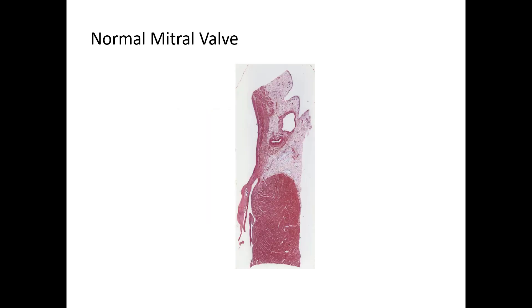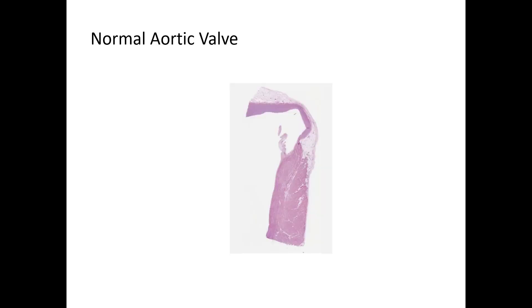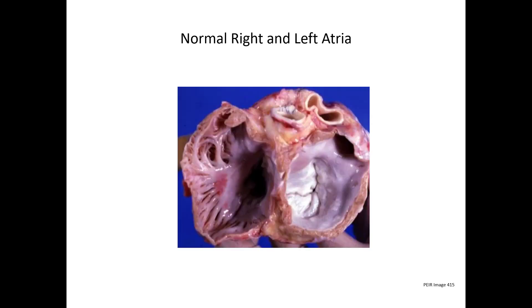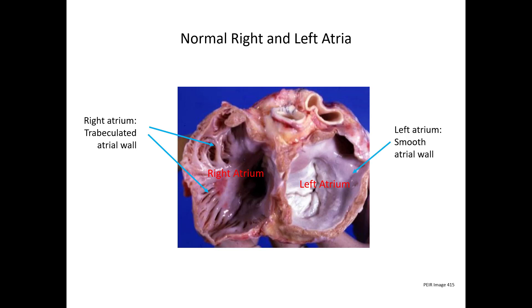Let's go on to our summary. The first slide was a normal mitral valve — you can stop the video and name all the structures to test yourself. The next slide was a normal aortic valve, and again you can test yourself. The next slide is a gross picture of the normal right and left atria. The right atrium has a trabeculated atrial wall, while the wall of the left atrium is smooth. This up here is the opening of the left atrial appendage.